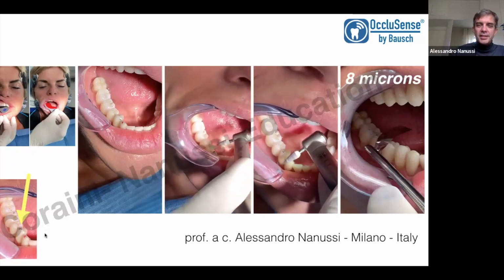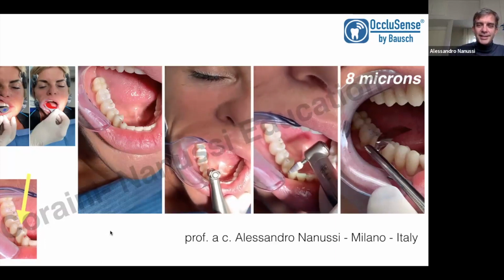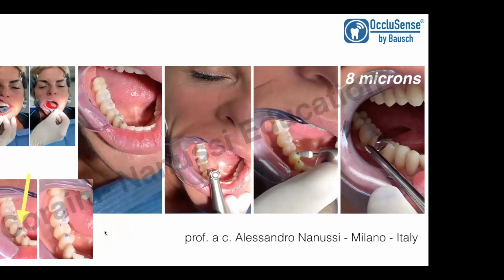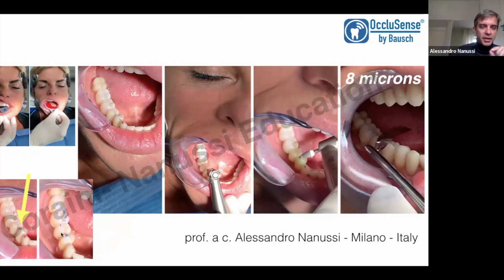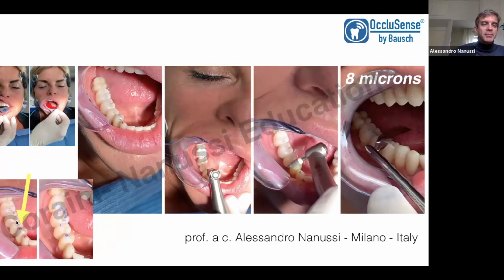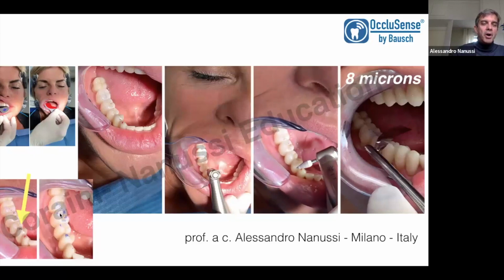And I am also really careful about the lateral guidance here on the canine. You can check the situation is totally different before and after the correction of this little precocity. Some microns, I know, but the contacts in the posterior area are totally different before and after. I have more points of contact on the first and second molar before this little grinding.